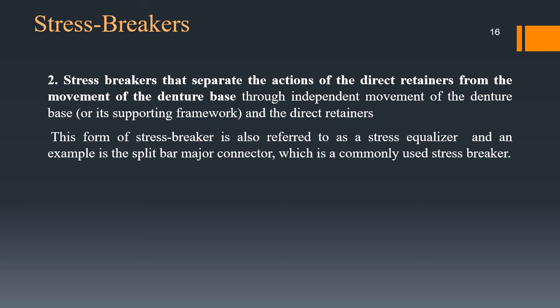This form of stress breaker is also referred to as a stress equalizer, and an example is the split bar major connector, which is a commonly used stress breaker.